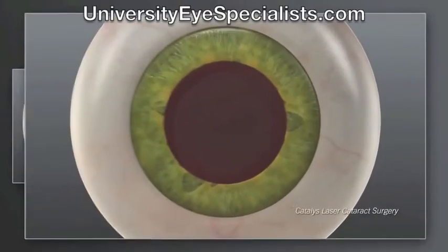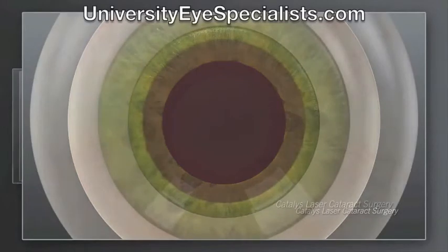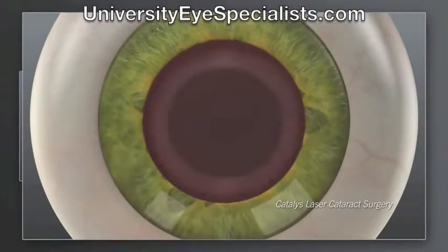With laser cataract surgery, we use the laser to make the corneal incisions with exceptional precision. We use the accuracy of the laser to create the circular opening in the capsule with the exact size, shape, and location.